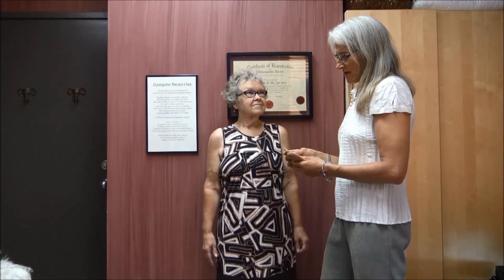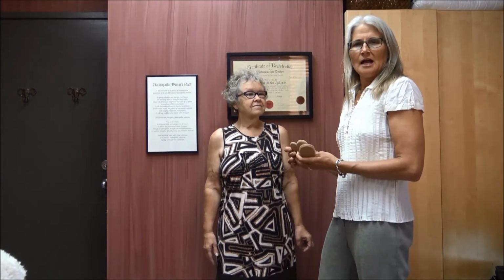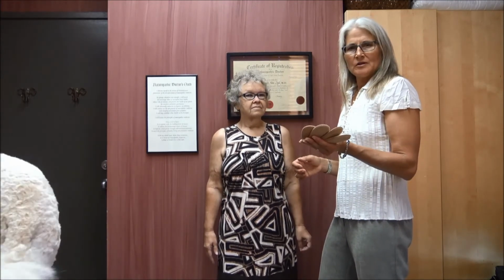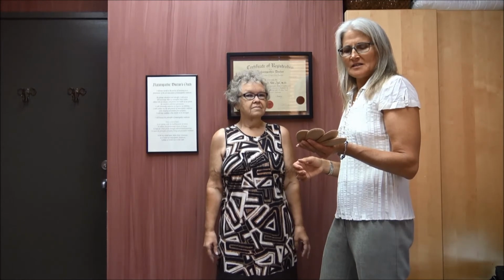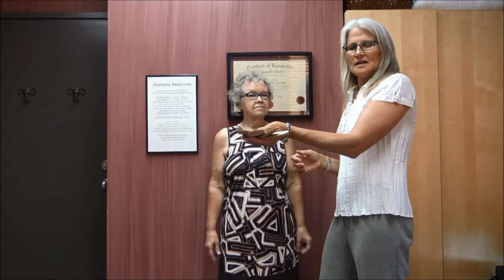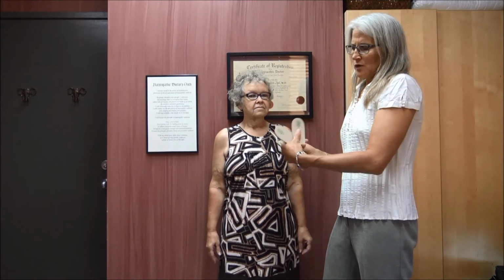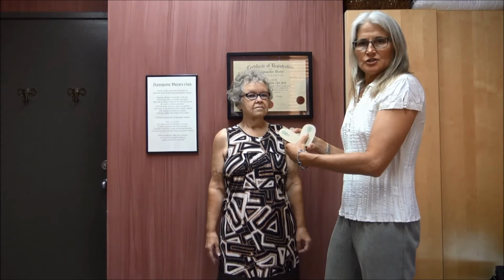What we're going to do right now is demonstrate to you how I would actually fit for a heel lift. So I think you remember from the video earlier on, there were 4 different heights, A, B, C, and D, and they get higher as the letters go up. The A is an 1/8, and then we go up to a 1/2 inch with the D.